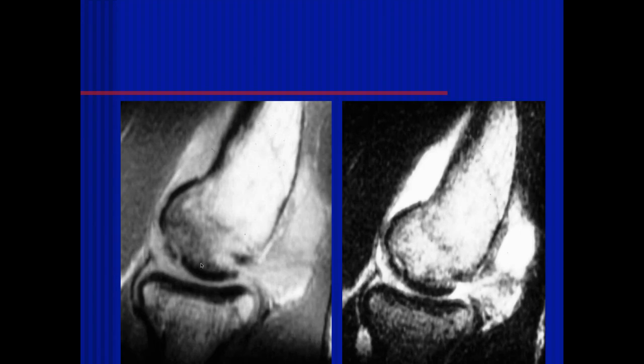All right, Jennifer. Here again, we see some cortical irregularity along the capitellum. It looks like a minimally displaced fracture. So what would you call this in your report? Fractured? Most people call this an osteochondral, subchondral injury.